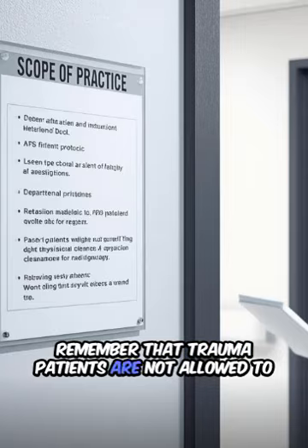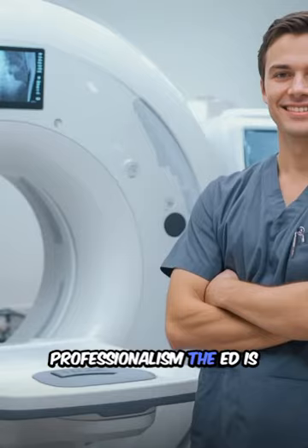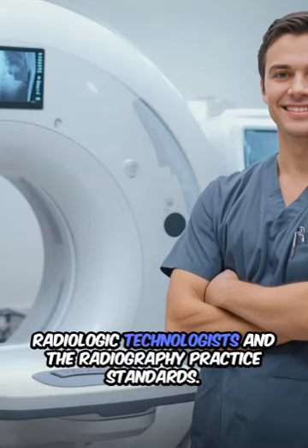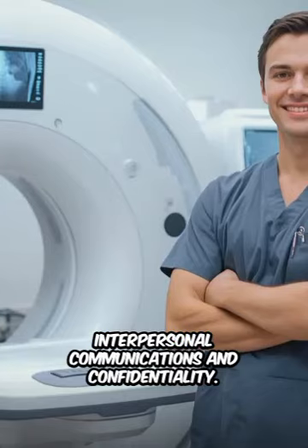Remember that trauma patients are not allowed to eat or drink unless permitted by the physician. Professionalism: the ED is an emotionally charged environment. Adhere to the Code of Ethics for Radiologic Technologists and the Radiography practice standards. Pay careful attention to appropriate interpersonal communications and confidentiality.